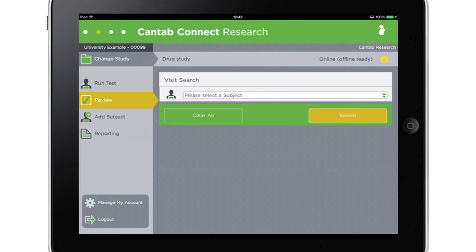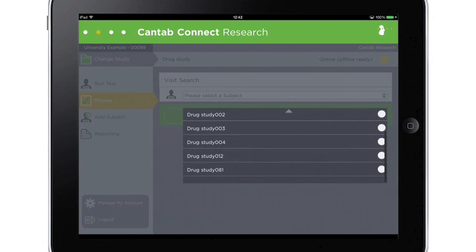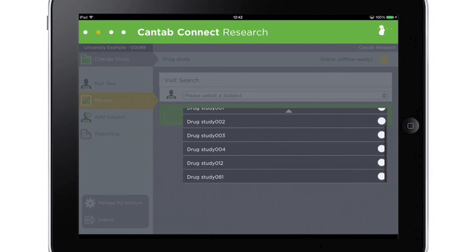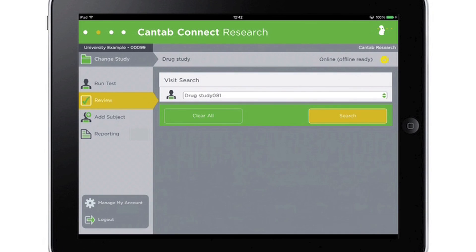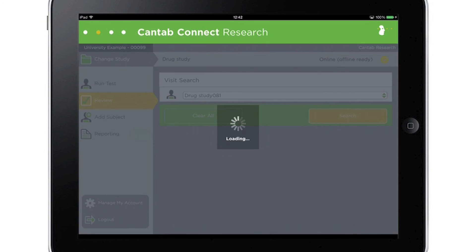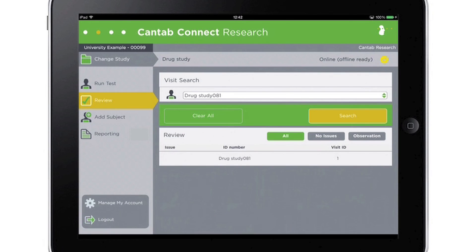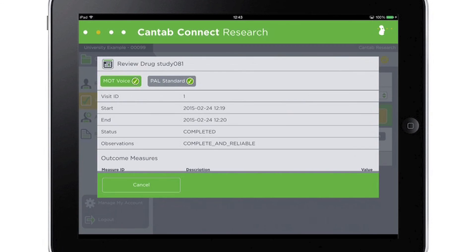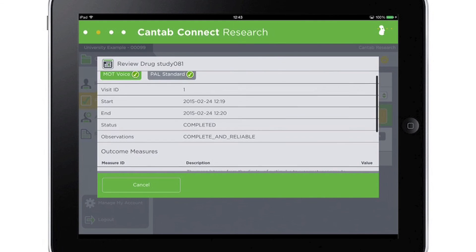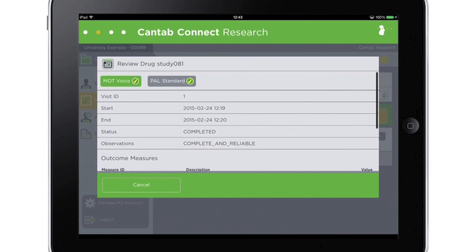Data for individual subjects can be viewed from the review screen. Researchers can search by subject to view all of the completed visits to see outcome measures and performance observations for each of the tasks.